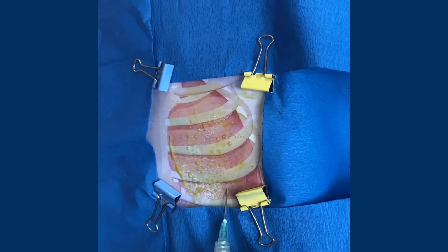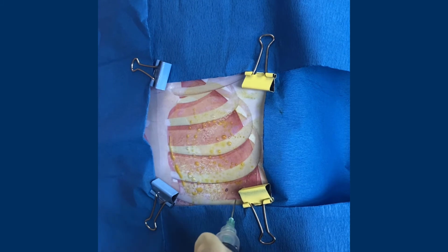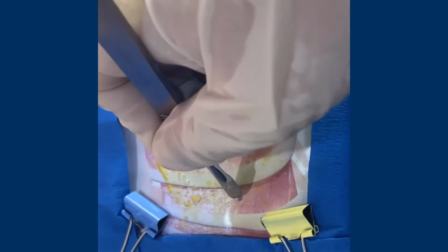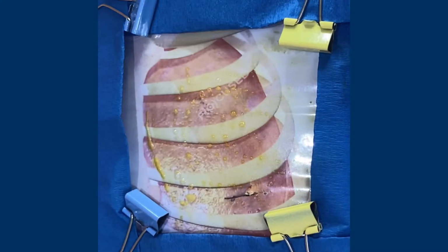Infiltrate the skin using local anesthetic and block the intercostal nerve branches. Make a 2.5 to 3 cm skin incision parallel to the axis of the ribs and into the subcutaneous tissue. Measure how far the chest tube is to be advanced after placement. The tip of the tube should be placed at the apex of the lung.